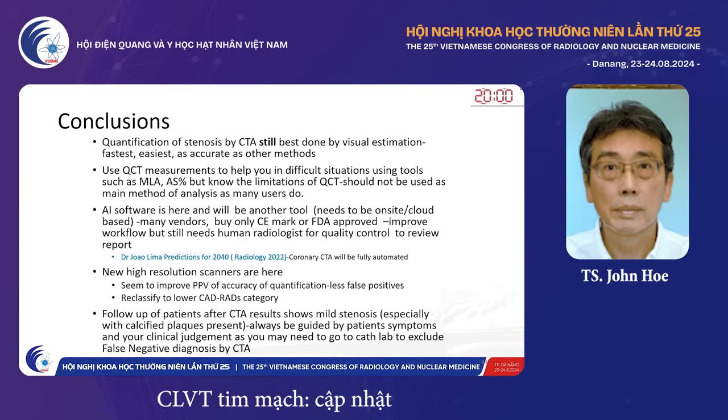If the CTA result shows mild stenosis, especially with calcified plaques, always be guided by patient symptoms and your clinical judgment, as you may need to go to the cath lab to exclude a false negative diagnosis by CTA.